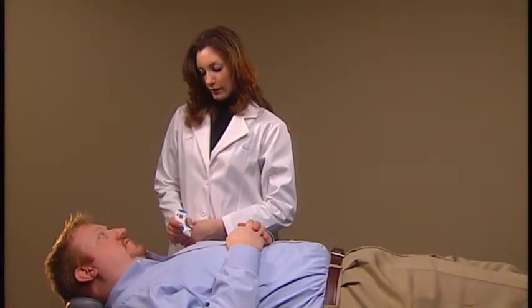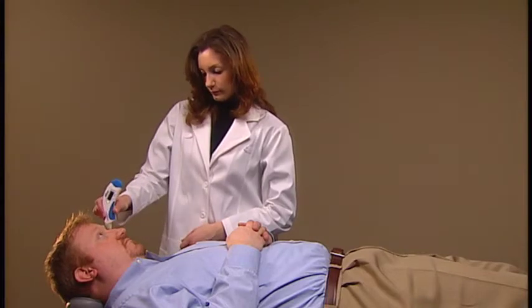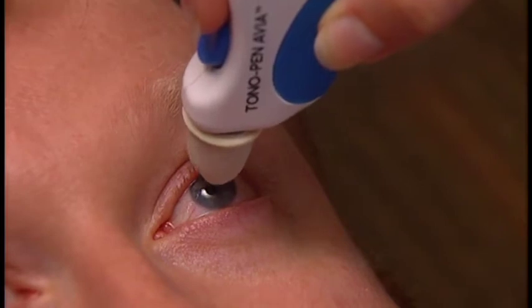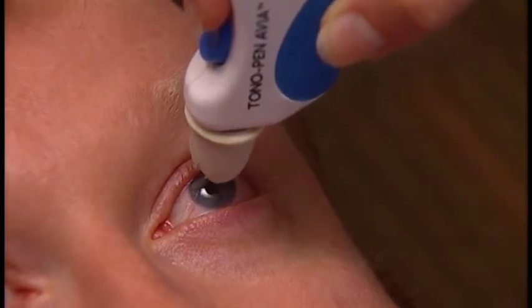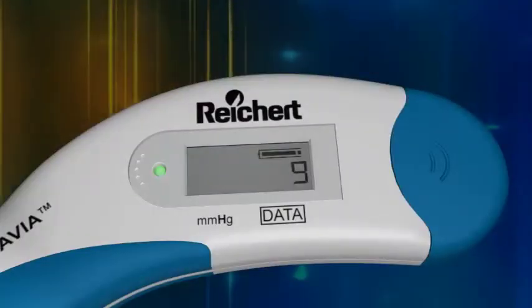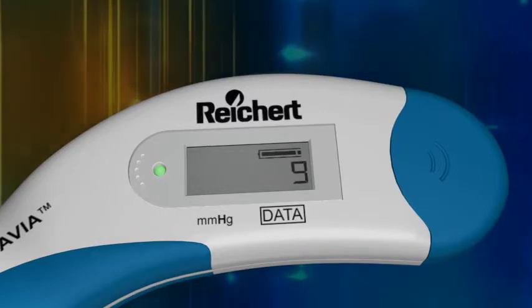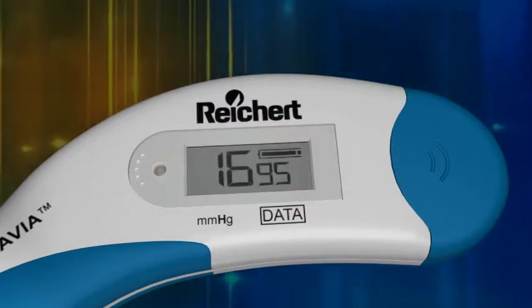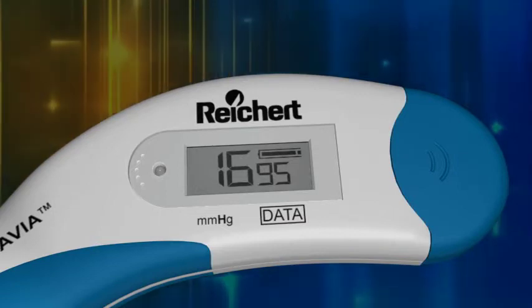And it's patient friendly too. Readings can be taken from any position and the patient does not feel discomfort when the device is gently tapped against the anesthetized cornea. In a matter of seconds, the LCD readout displays an average of up to 10 IOP measurements along with a statistical confidence indicator.